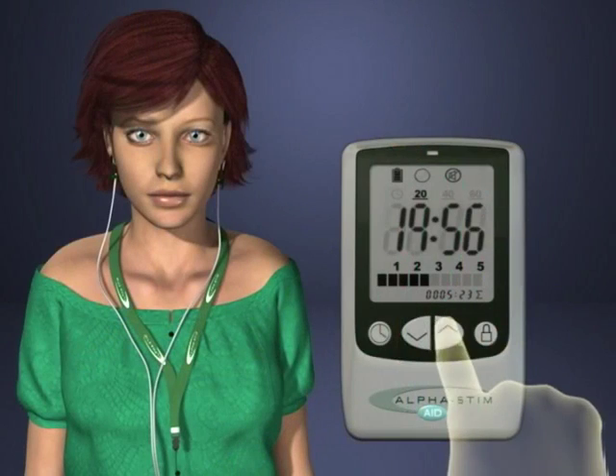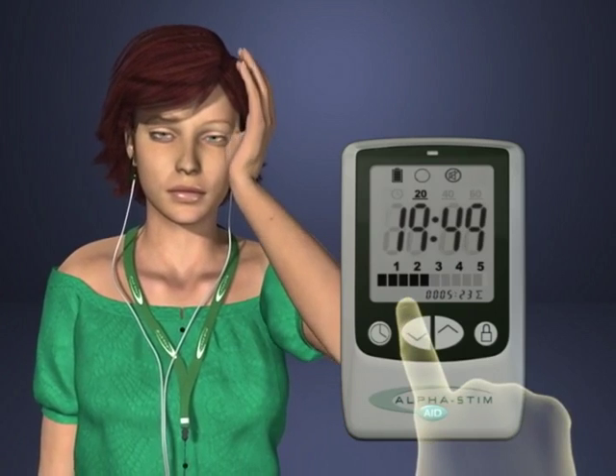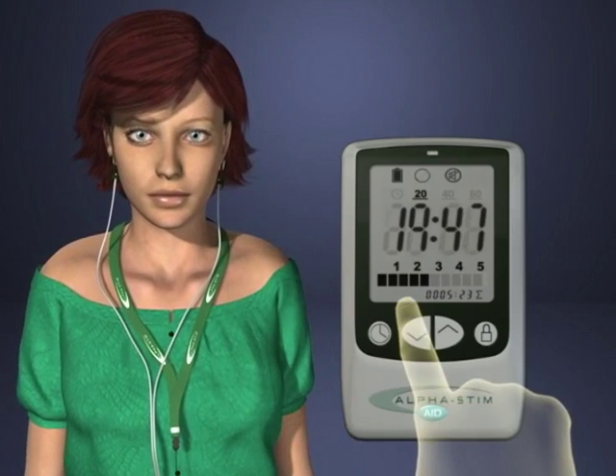Increase the current slowly until a dizzy feeling is experienced, like rocking on a boat, then decrease it immediately until the dizziness stops. Also decrease it if the normal tapping sensation felt on the ear lobes becomes uncomfortable.